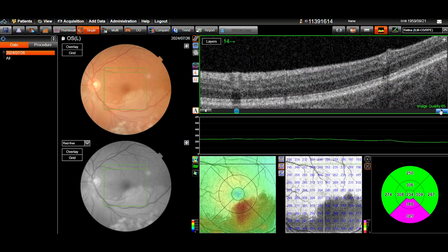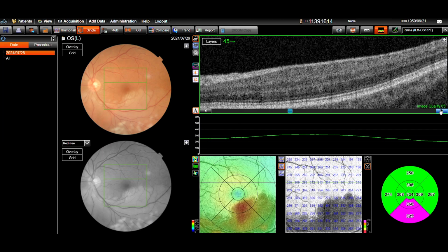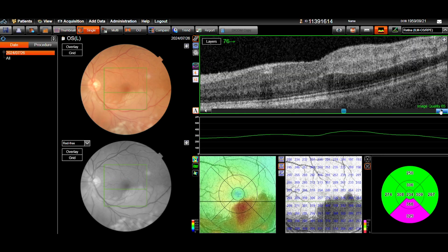The images are reviewed oftentimes within about 15 to 20 minutes, and we look at the images and then ultimately can make a diagnosis. The nice part about it is there are hallmark features to the identification of a CRAO, where we get this reflectivity in the inner retina, and that is really pathognomonic for the diagnosis. So we know their basic vision, we then have the OCT and fundus photo features, and can make a decision very quickly. The Maestro has allowed us to connect to other doctors.